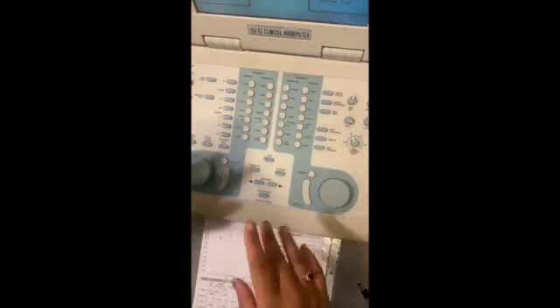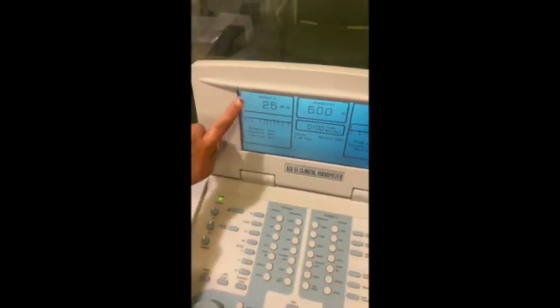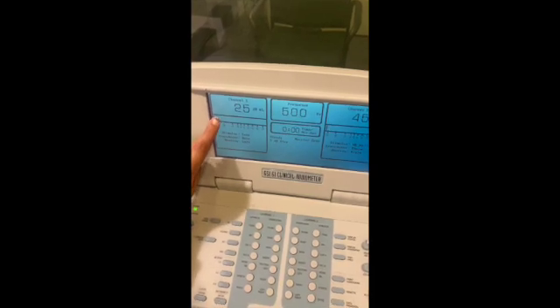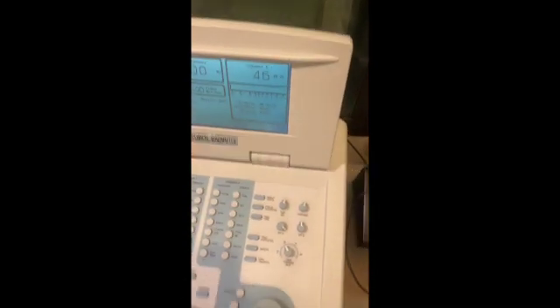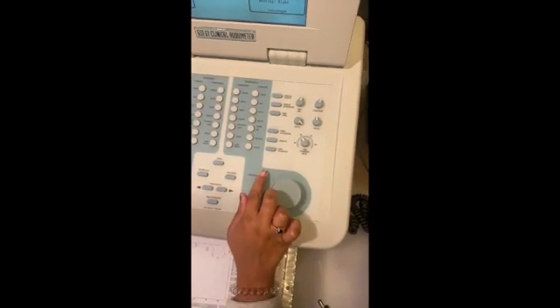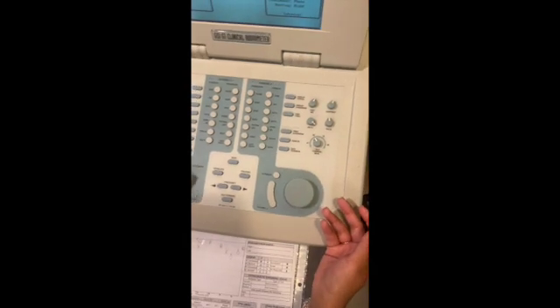And then you will have over here for channel 1, your left ear, you're starting at your previously established bone conduction threshold, which is why this is at 25 dB. And then in channel 2, you're starting at your right ear air conduction threshold plus 15, which is why this is at 45. So then when you're going to begin your testing, you're going to turn on interrupt for your masking noise, and you will press this to begin presenting the tones to the patient.